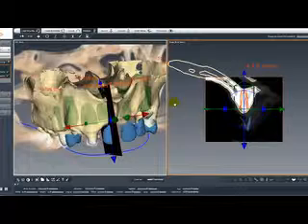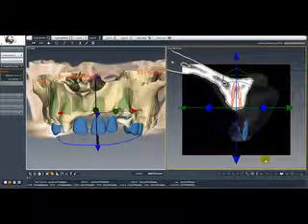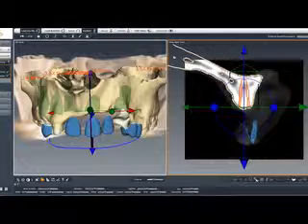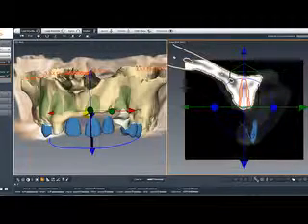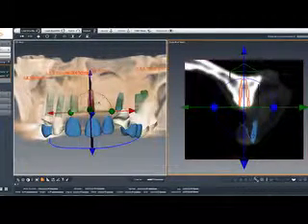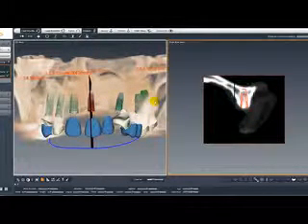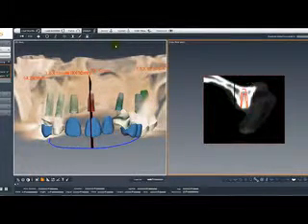I will go ahead and show you the left side, which will be a little bit more challenging next. So the next implant will be on tooth number 9, and it would be ideal, as I showed you before, to have the 8 and 9 implants as the anterior most position for the biomechanical reason. Removing the bone in here, as you can see the defect that we have in here, I placed an implant in there, and this will be a 3.5 by 10 millimeters.